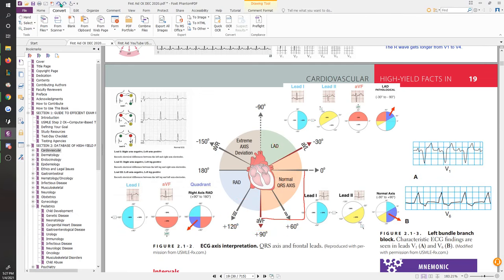Honestly, this is a very complex thing that you don't really need to know very, very well. The only thing you need to know is how to pick that answer choice, right? Getting good at axis deviation, figuring it out and stuff like that. There's a lot of images here to help you see that and look for things on your ECG. Always you're going to be looking at things for 1, 2, and AVF. Those things will come with practice, and you'll get there when you get there.